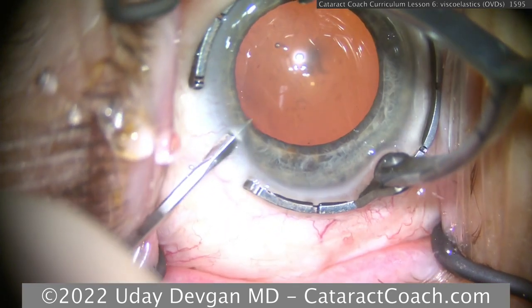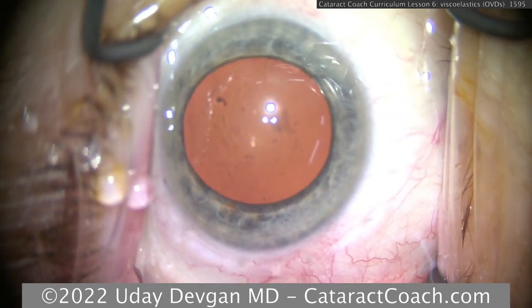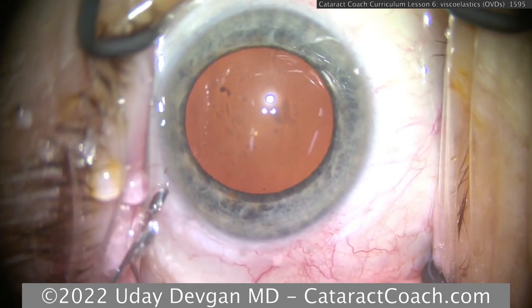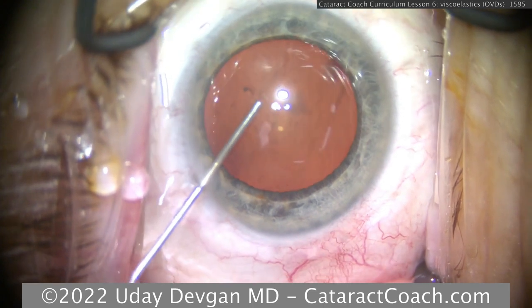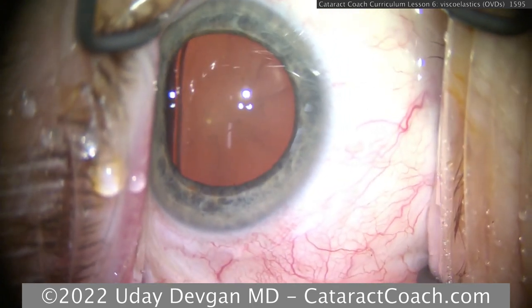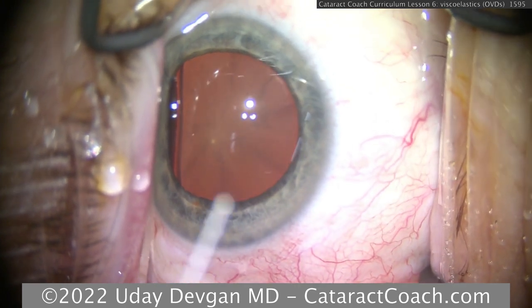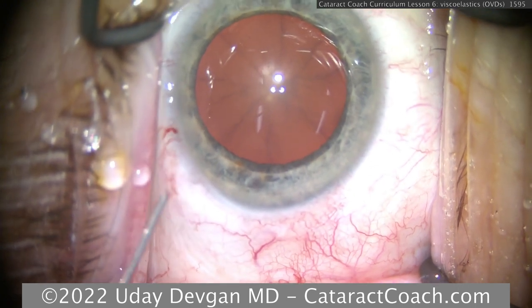CataractCoach.com. We have routine cataract surgery here, and I want to show you the soft shell technique that was popularized by Steve Arshinoff. So starting out a routine case, putting anesthetic, so that's preservative-free lidocaine, in the eye and on the cornea. Now, for the soft shell technique, first we're going to instill a dispersive viscoelastic.